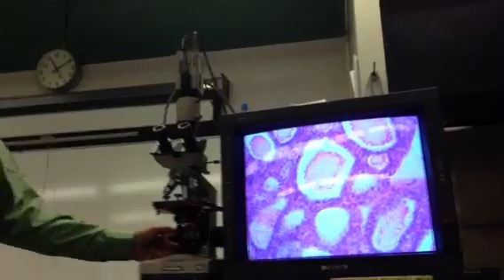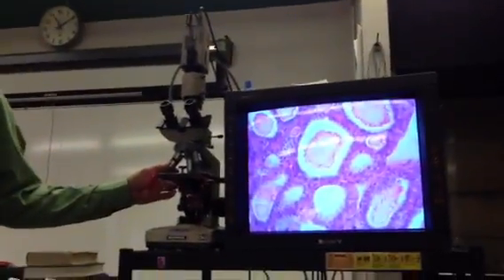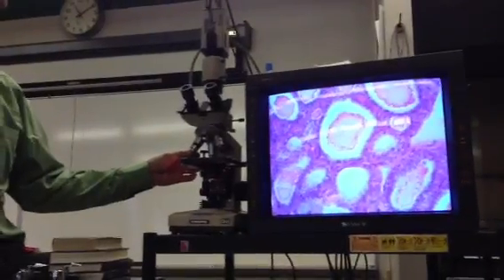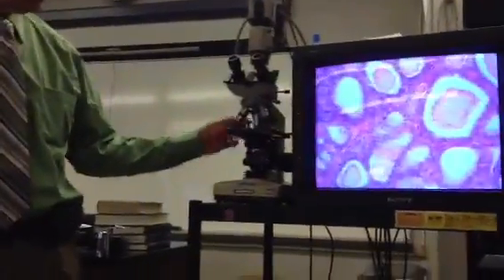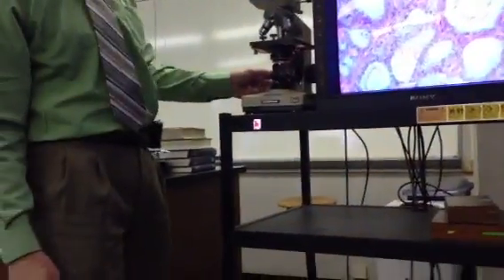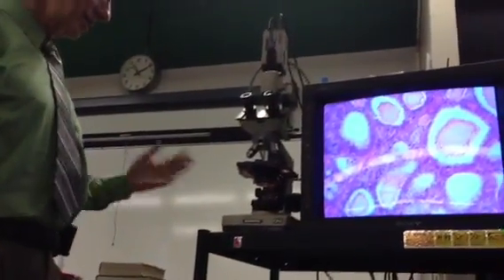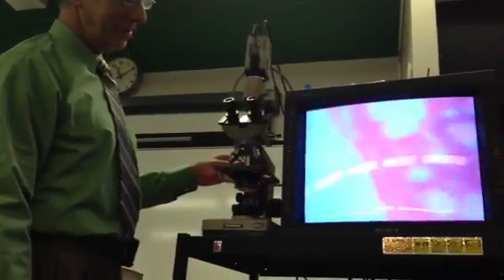They tend to be kind of large, although that's not totally chromophobic, but it's slightly chromophobic. They don't necessarily appear in clusters. Sometimes they're isolated, but here's a cluster of a couple. They're C cells, you said? C cells, which is short for clear cells, also known as parafollicular cells. They secrete calcitonin, which has the opposite effect of the parathyroid, which is across the river here, in the other gland.